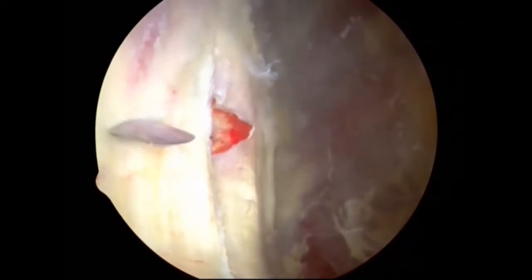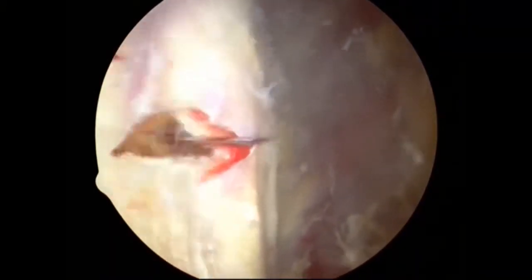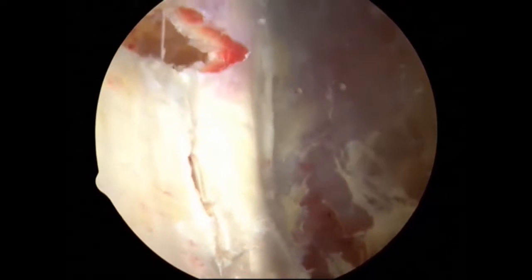The length of the incisions is adjusted to the size of the patient and titrated to the amount of tension on the tendon.